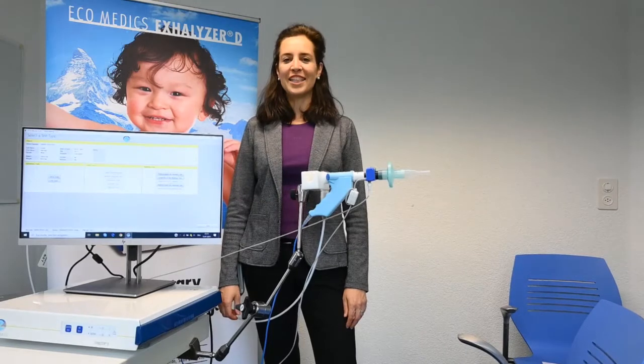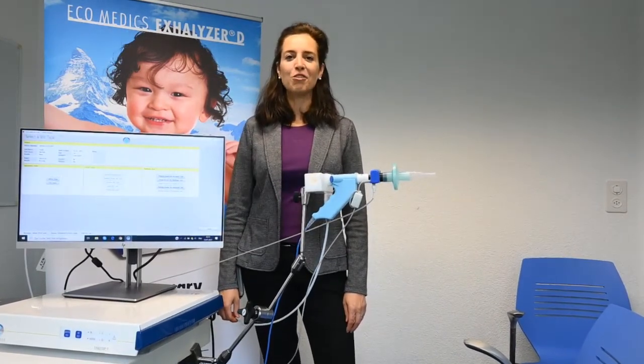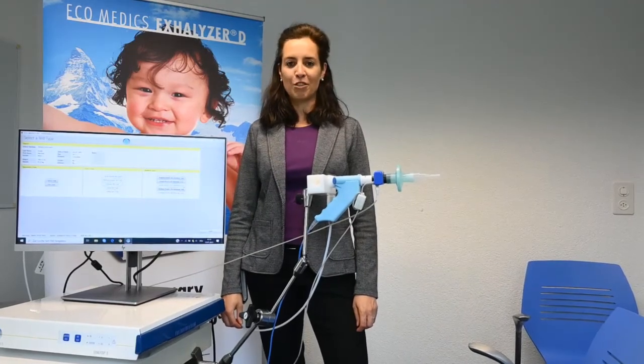Hello, my name is Birgit Schelling from Ecomedics company. Today I would like to show you how to perform a nitrogen multiple breath washout test.